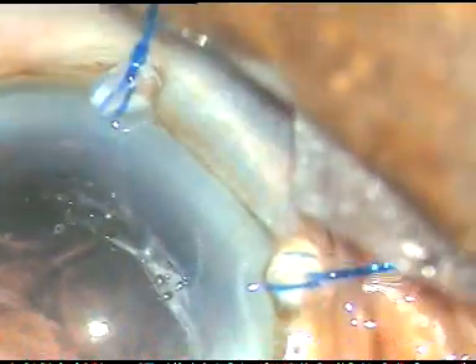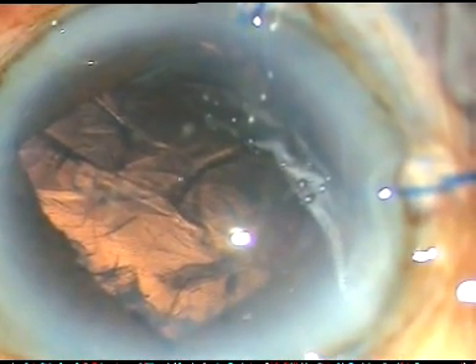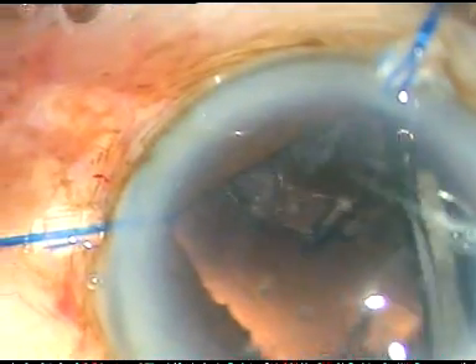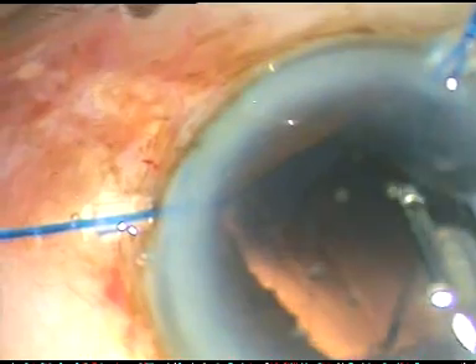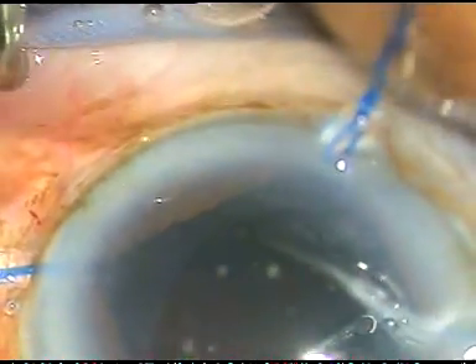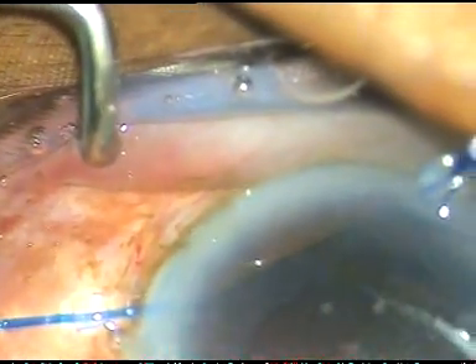Now I inject viscoelastic substance, support the bag and then come out. Now I am going to remove the cortical matter. Since I have done hydrodissection, removal of the cortical matter is not difficult. I have done some CTR implantations without hydrodissection and in those cases removal of the cortical matter was a bit clumsy. That is why in this case I did a bit of hydrodissection and then implanted the CTR.